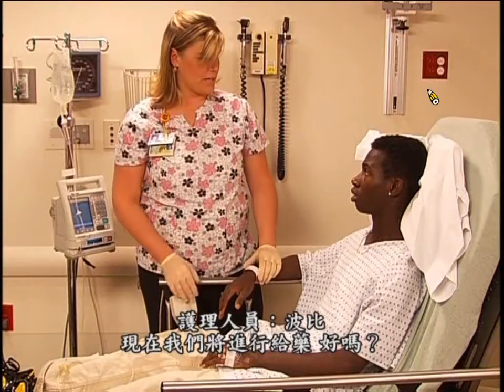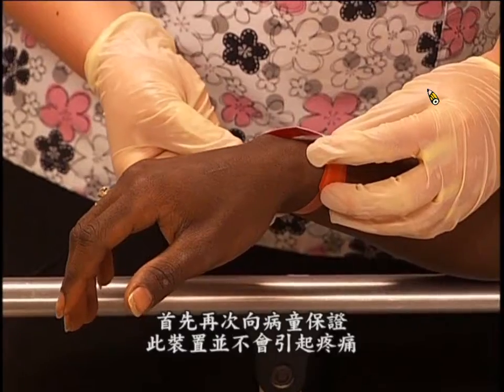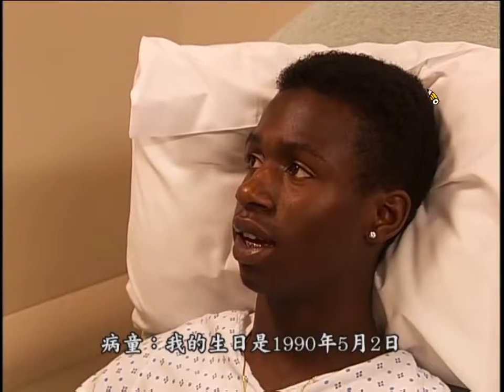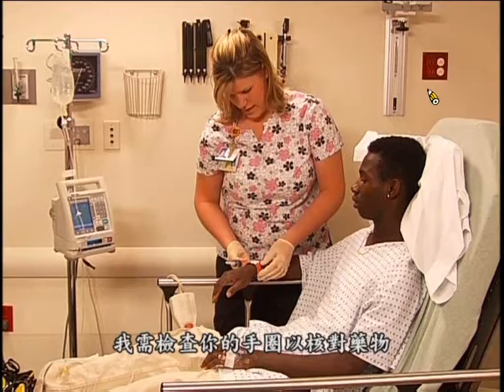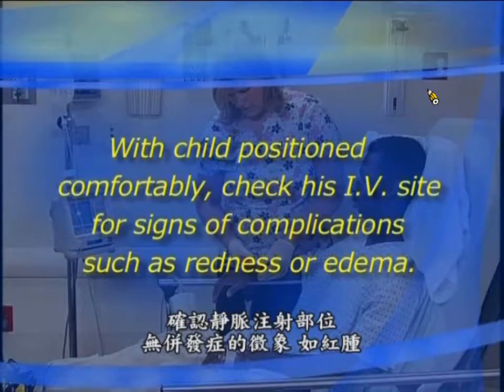Okay, Bobby, now we're going to give you your medicine. Okay? To administer medication through an intermittent infusion device or medication lock, first reassure the child that it is painless and instruct him to remain still for the procedure. May 2nd, 1990. Thank you. And this is your antibiotic, okay? So I'm just going to check your name band against your med. With the child positioned comfortably, check his IV site for signs of complications, such as redness or edema.